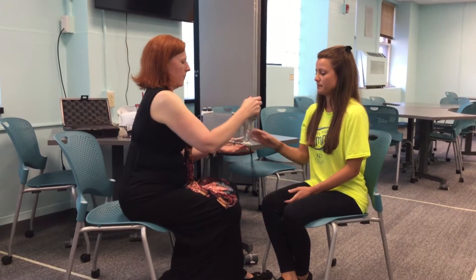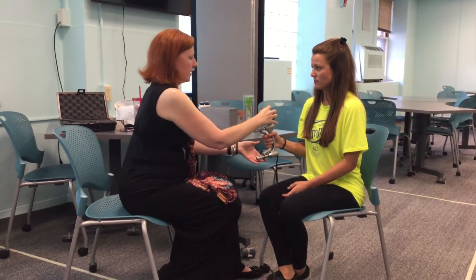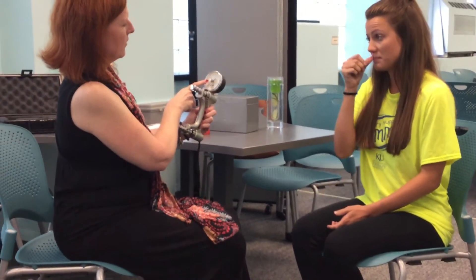I'm going to have you hold the tool just like this, arm at your side. You're going to squeeze as hard as you can — it's not going to budge, but it will record how much pressure you're applying. So give me a good squeeze. I'm reading the inside — she scored about 64 pounds on that one.